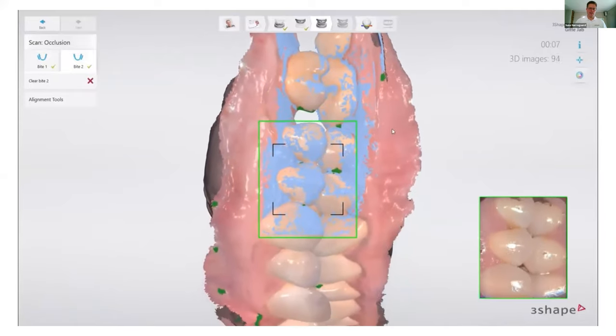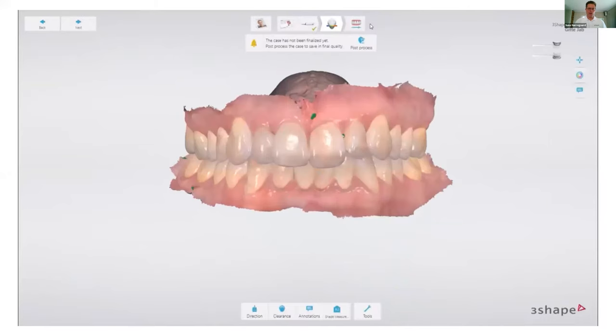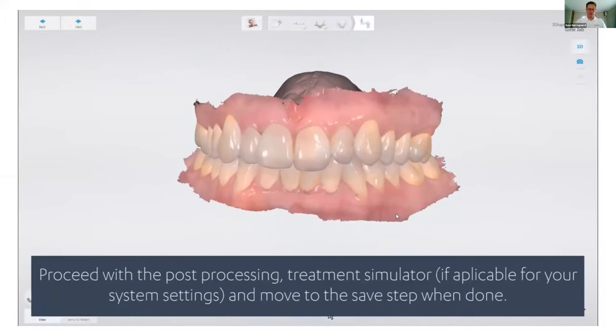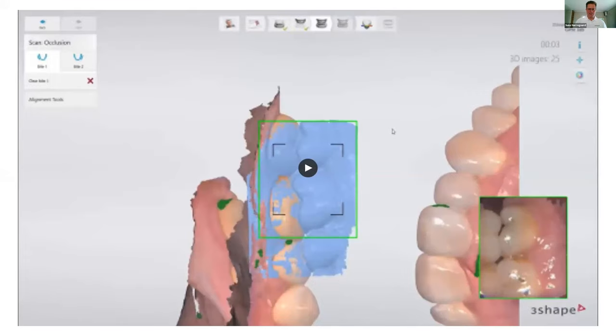And these you then send out to your provider, clear aligner provider, or your lab, or you continue with the software that you have on your workstation. So this is the process that we've been going through, and you saw the workflow bar up at the top, and you can see it here. So those are the steps that are required on the scanner to get a good scan.